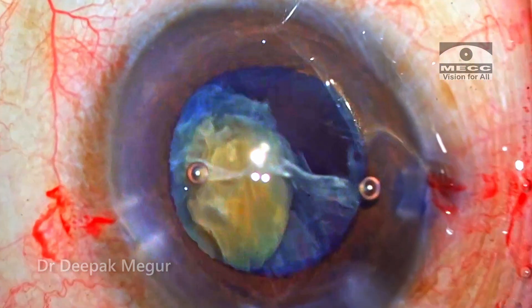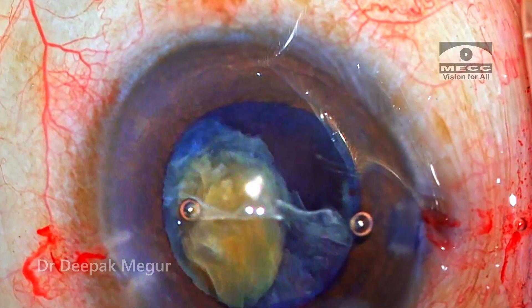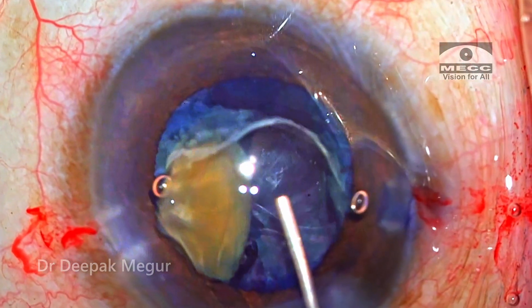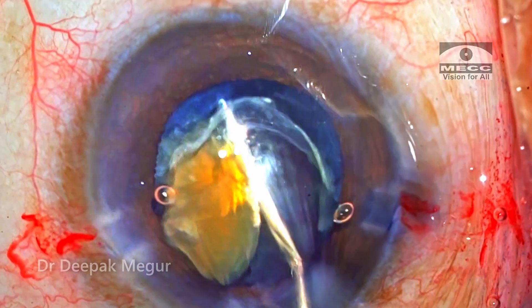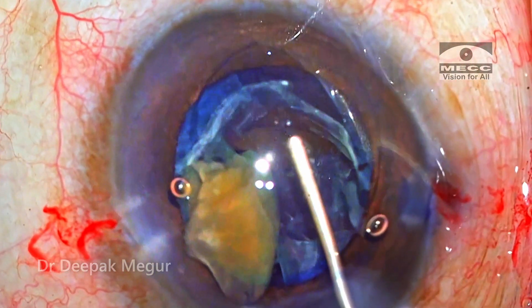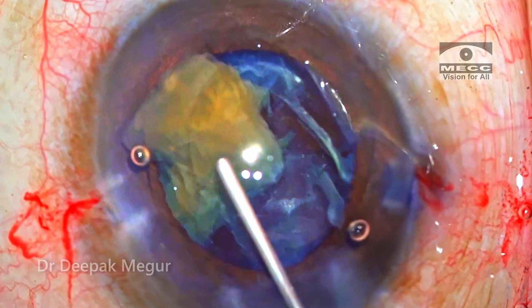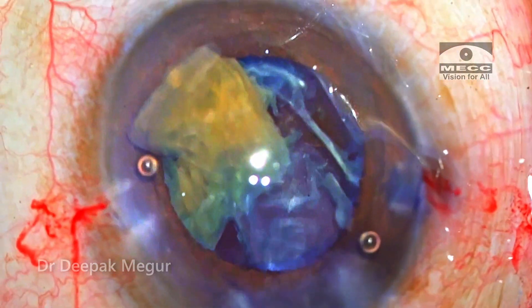Visibility is not very clear. I can't really delineate what is posterior capsule or where is the epinucleus. So I just go back and inject dispersive OVD below the nucleus. With the same cannula, the two fragments which are attached to each other are levitated out of the capsular bag.